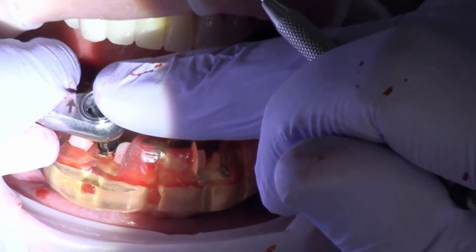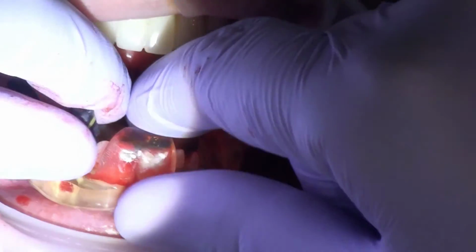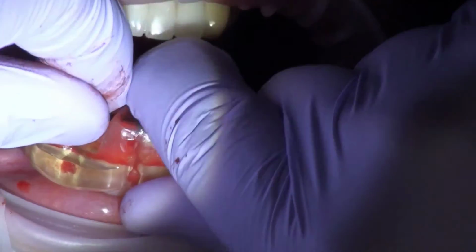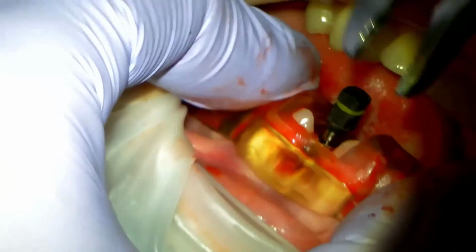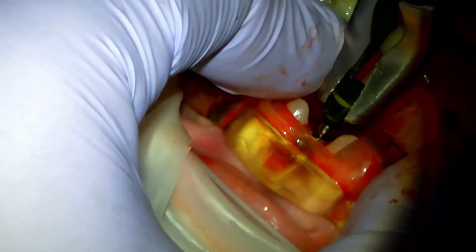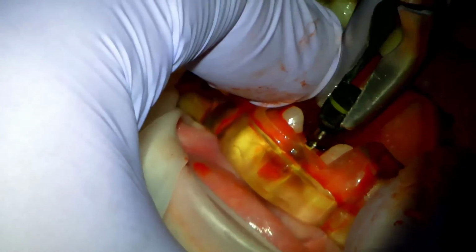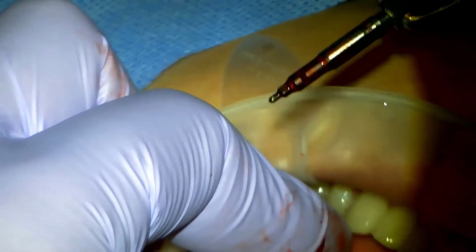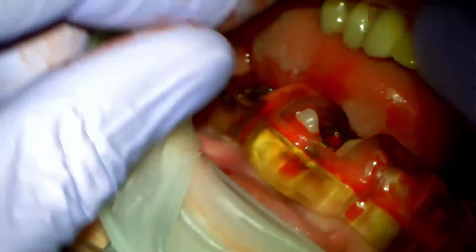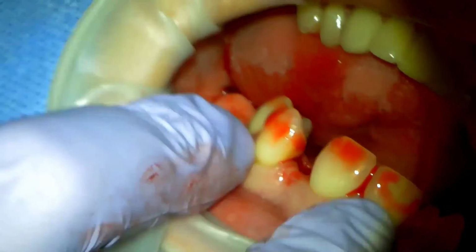I'm going to go ahead, take this off, and then we're going to see how everything else fits. Sometimes these mount drivers are a little tricky to come off. I like to grab them with the rongier, slight little wiggle movement, and get this to come out. They are really tight in there. That's nice because it lets the implant be nice and tight in terms of its surgical accuracy, but sometimes it's challenging to come off. So now we'll take this off.